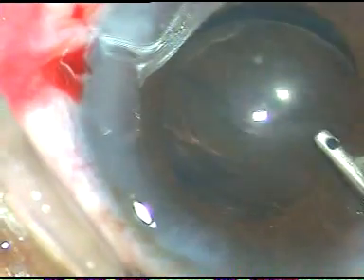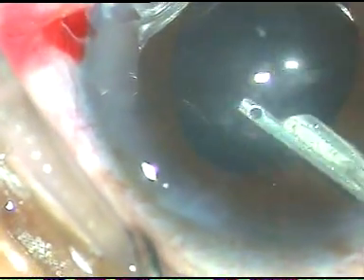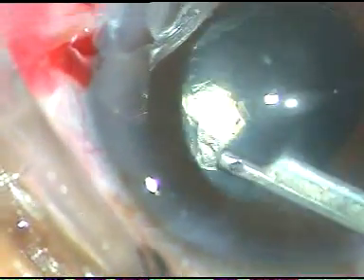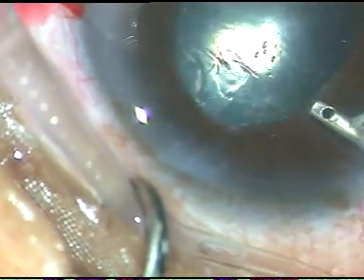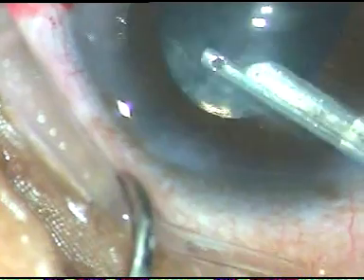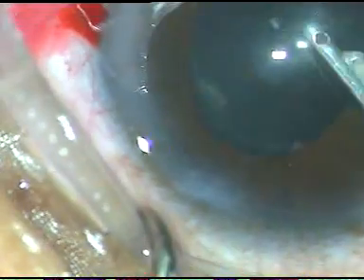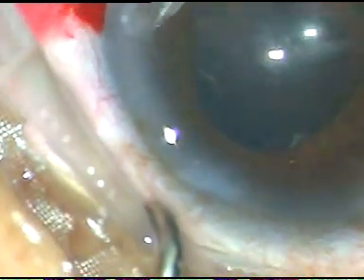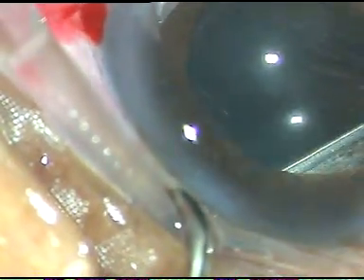Now the viscoelastic substance that was used, in this case it was 2% hydroxypropyl methyl cellulose, is removed nicely. Now when I was removing the viscoelastic substance, I could see some cortical matter at around 12 o'clock. So what I do is I go through the side port which was at 8 o'clock and I remove this cortical matter. Yes.